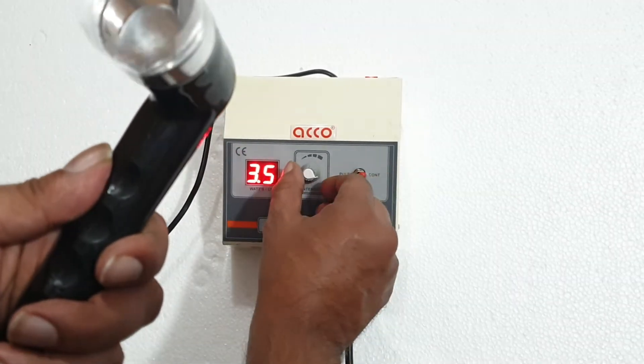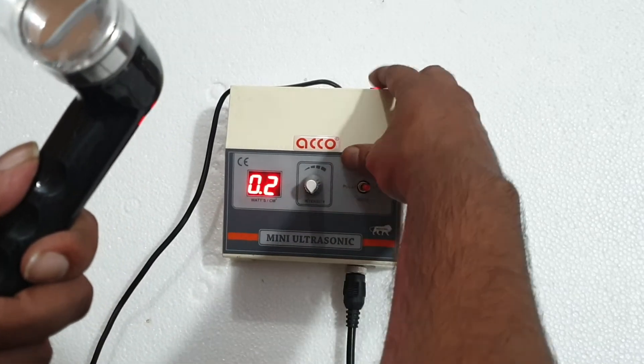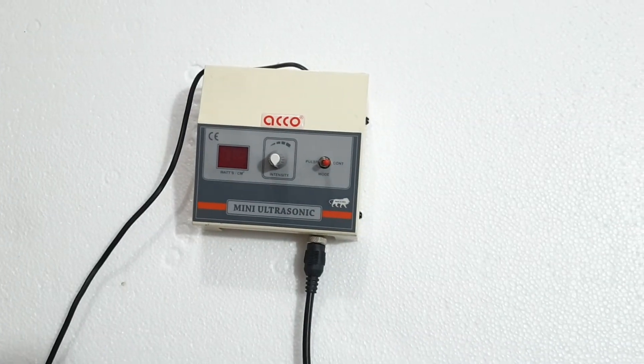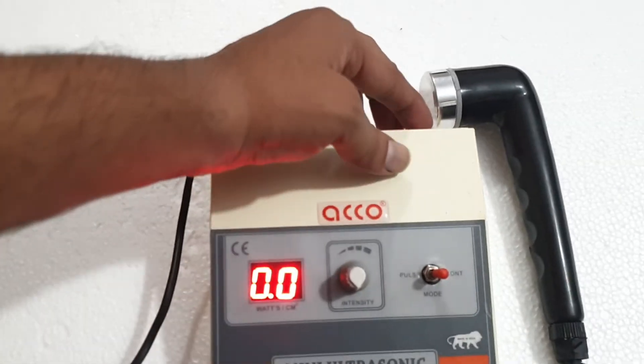Once the treatment is completed, make the intensity knob at 0, then switch off the machine. Clean the handle and wire properly. Switch off the machine.